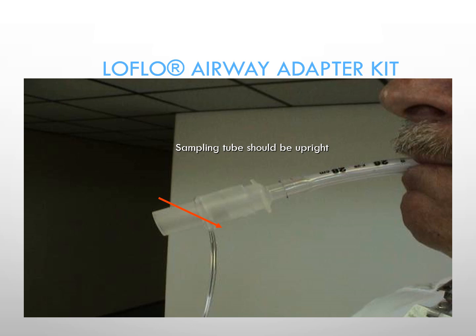Otherwise, it's not just having to change out the actual adapter, but it's also exposing the patient to the introduction of microbes into the ventilatory circuit, which can cause a respiratory infection, VAP, and even worse than that. So just keep that in mind as well.